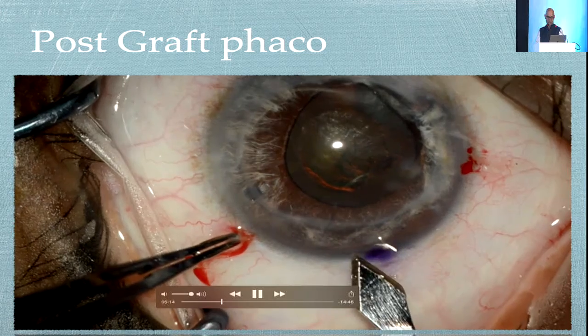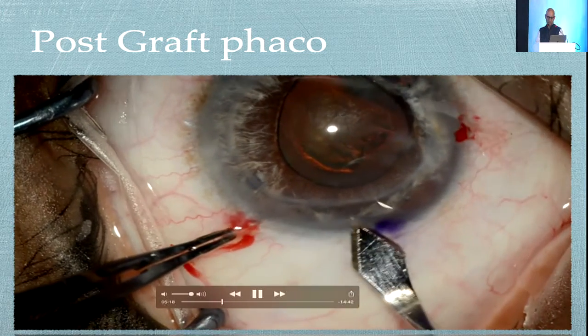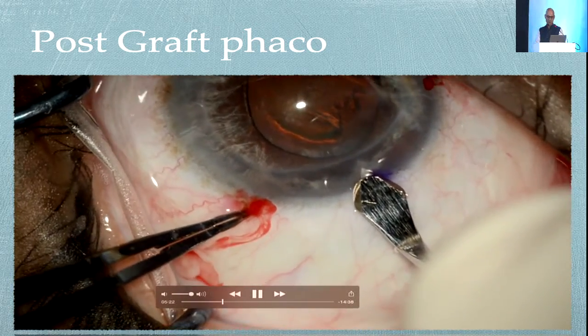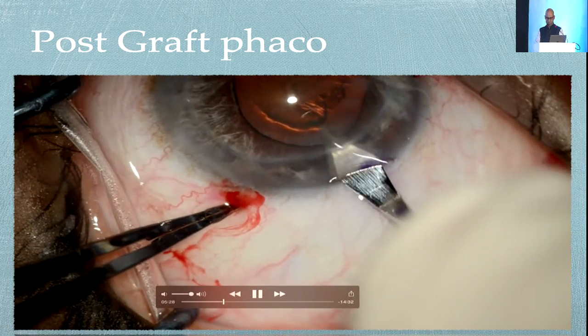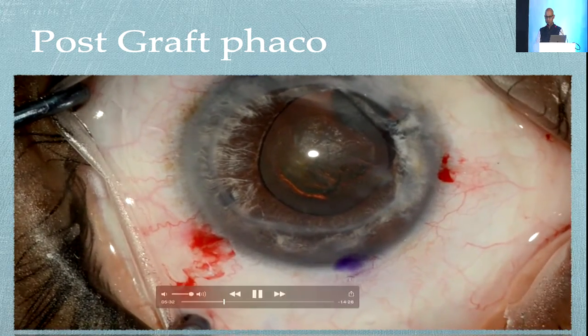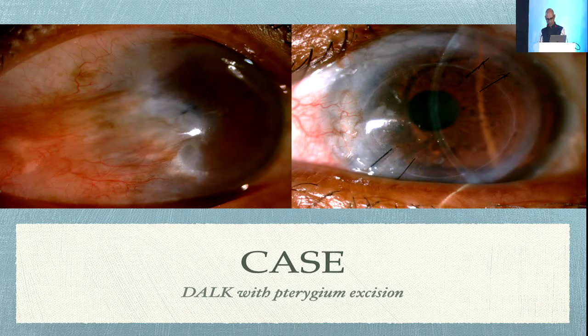Post-graft eyes, again, are prone to damage to the endothelium. It's a precious endothelium, so you have to treat it like any case with a low endothelial count, and you have to do all the measures like soft shell, using the right OVDs like viscoadaptive OVDs. Try to do most of your phacoemulsification in the bag, low flow, intermittent injections of viscoelastic, etc.